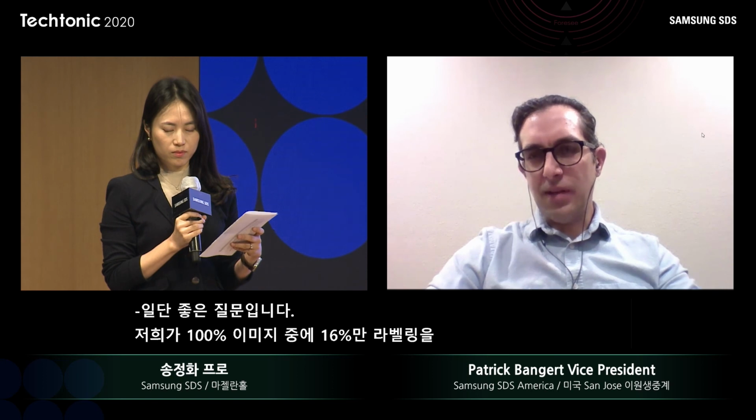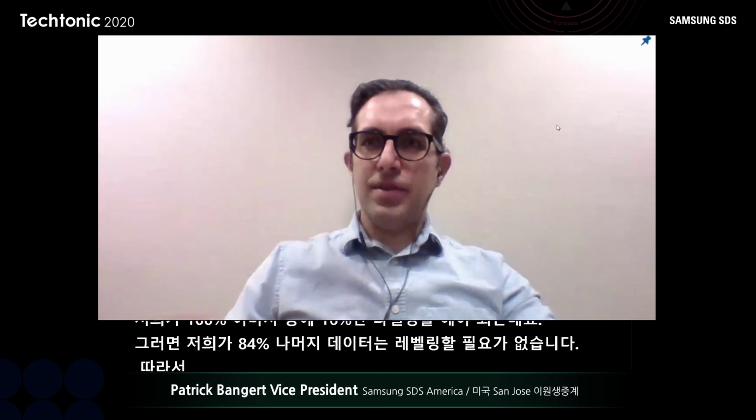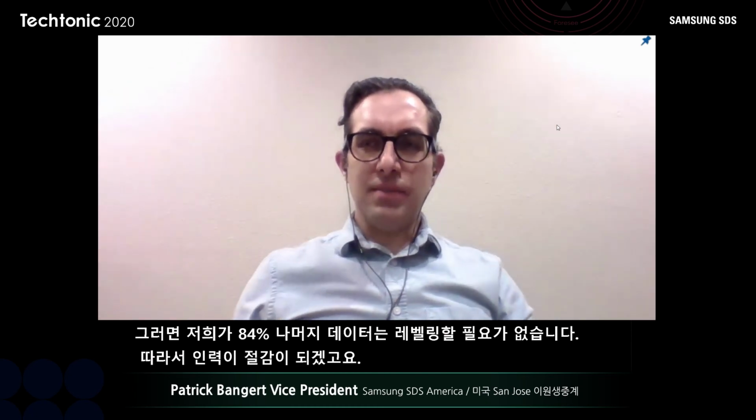Yeah, good question. So as I said, we had 100% images and had to label only 16% of them. That means the other 84% of the data was not labeled by a person, it was labeled by the AI model. Now, those 84% of the data have to be checked by a human being. That's of course faster than labeling it itself, but it still represents a small amount of work. So the amount of man hours doesn't go down from 100 to 16, it goes down approximately from 100 to 30, so we save roughly 70% of the manual effort.